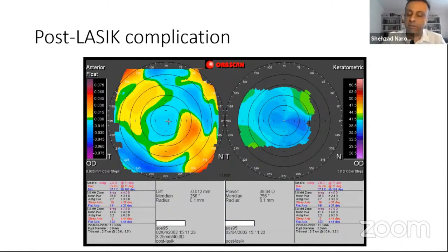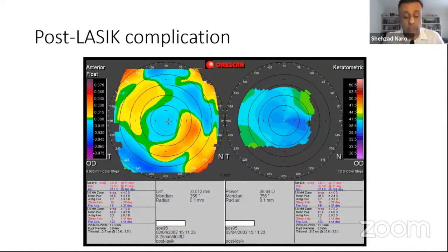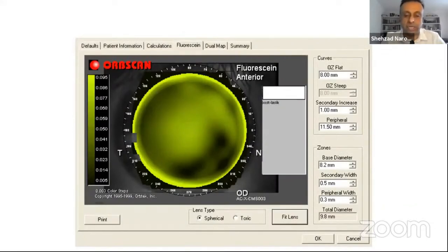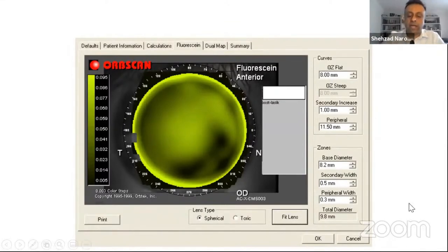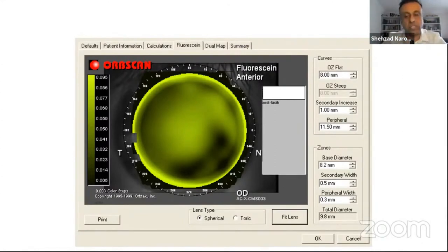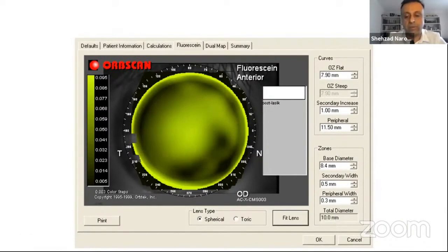Keratoconic lenses weren't quite right because the center was flat as well, so I used the topographer's built-in contact lens fitting simulation software. The Orbscan suggested fitting with an 8.00 BOZR lens, total diameter 9.8 mm — a steep fluorescein pattern, but that's what was recommended. I ordered it; the lens destabilized immediately. I then tried a steeper, larger-diameter lens — 7.9 BOZR, 10 mm diameter (increasing the sag) — the fluorescein pattern looked steeper, but again the lens decentered and the patient was unhappy.